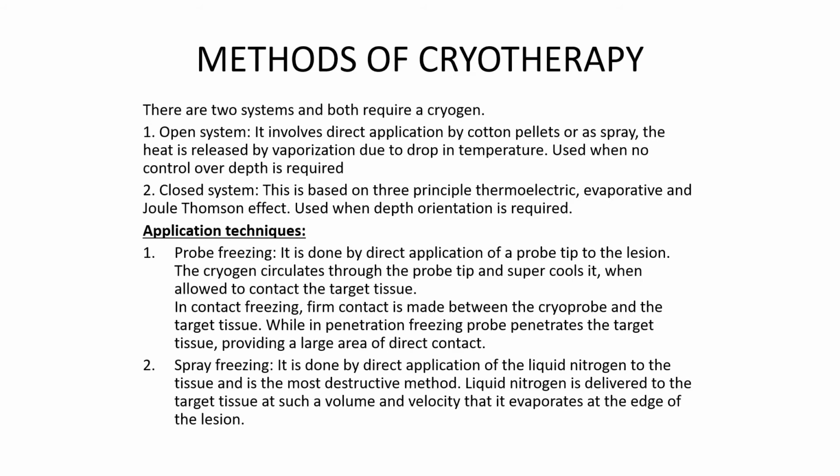عندنا system ثاني closed system. This is based on three principles: thermoelectric, evaporative و Joule Thomson effect. تستخدم when depth orientation is required. هسه نجي للابليكيشن تكنيك شلون نسوي له application للcryotherapy.